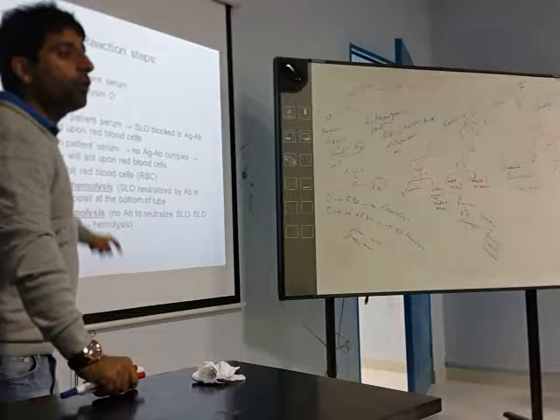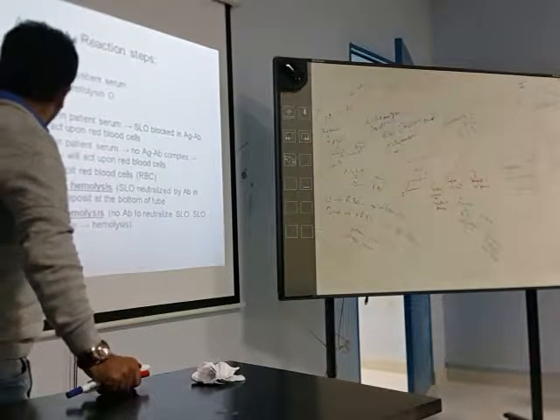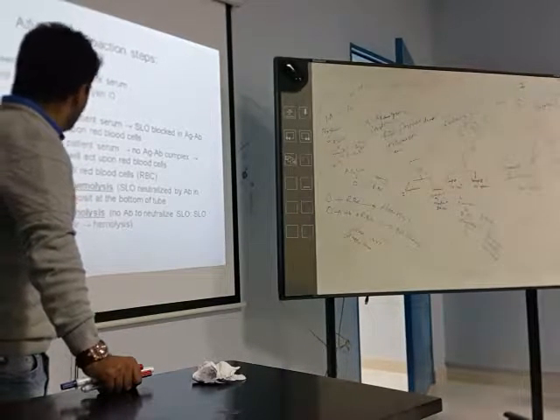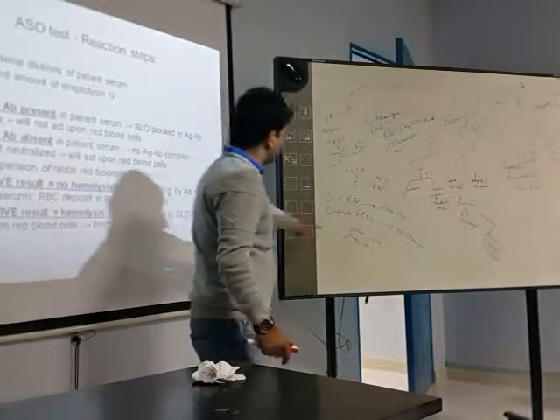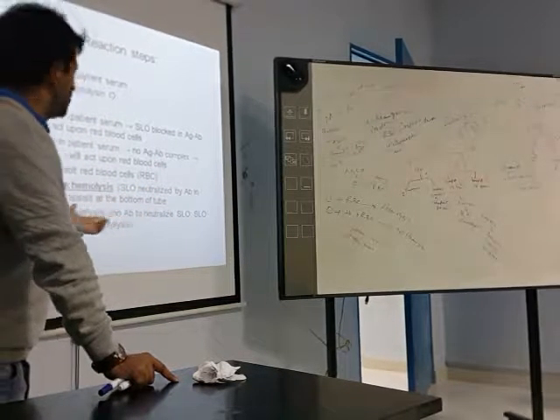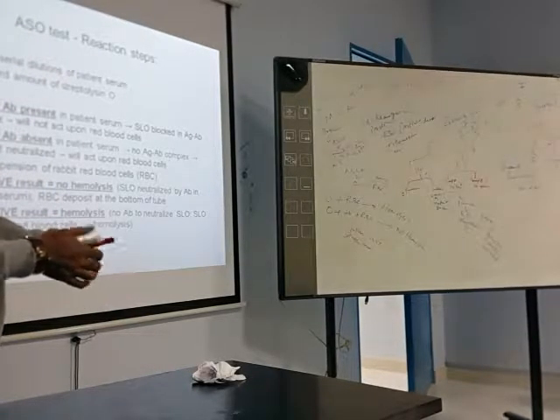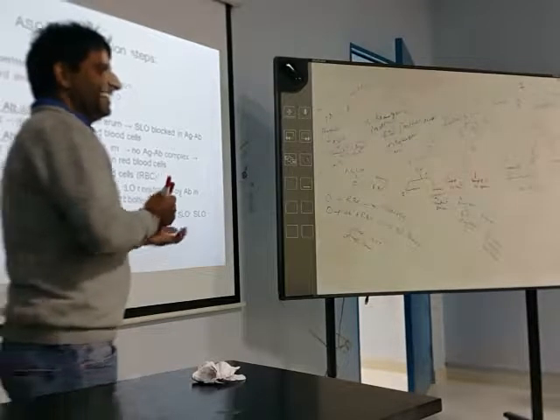Positive result means no hemolysis, which is written on your lecture. Why no hemolysis? Because of the presence of antibody. And negative result means there is hemolysis, because antibody is absent. Tell me how many understand this test? I understand. Very good. Yes, it's complicated.